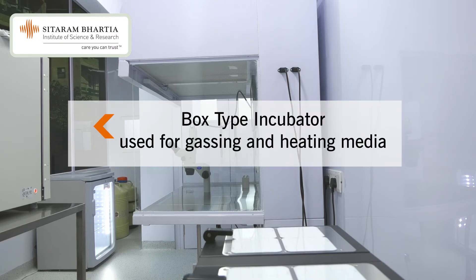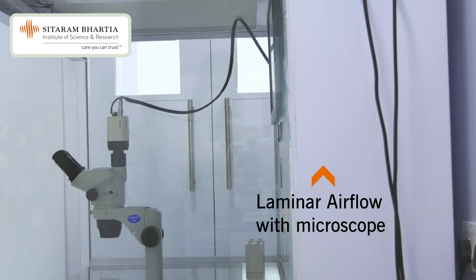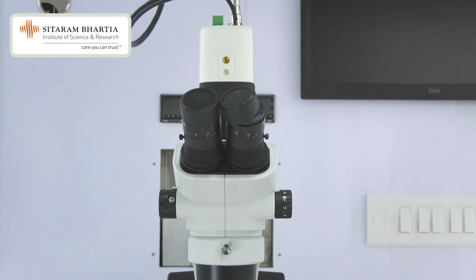This is a box-type incubator, and this is the Pharma 160i. We use this equipment for gassing of our media and heating for them. The next equipment is EmbryoMate. And this is a beautiful LAF laminar airflow which gives us a good flow and where we can handle our gametes. We can do all kinds of manipulation.